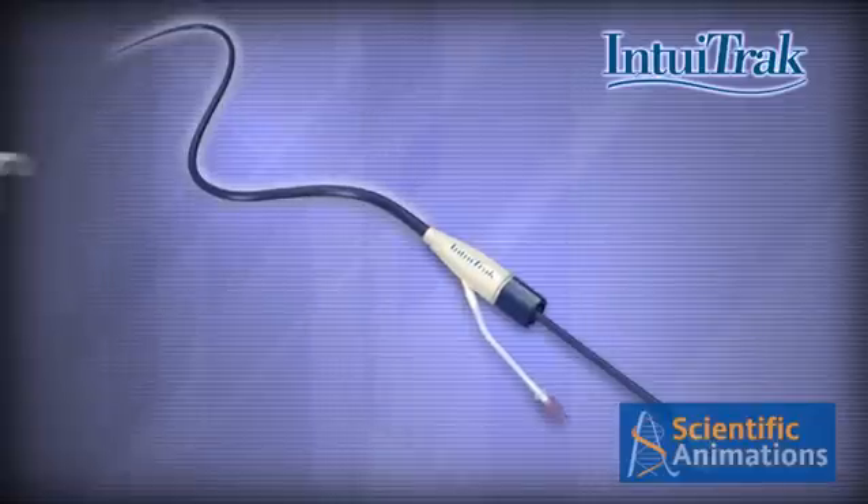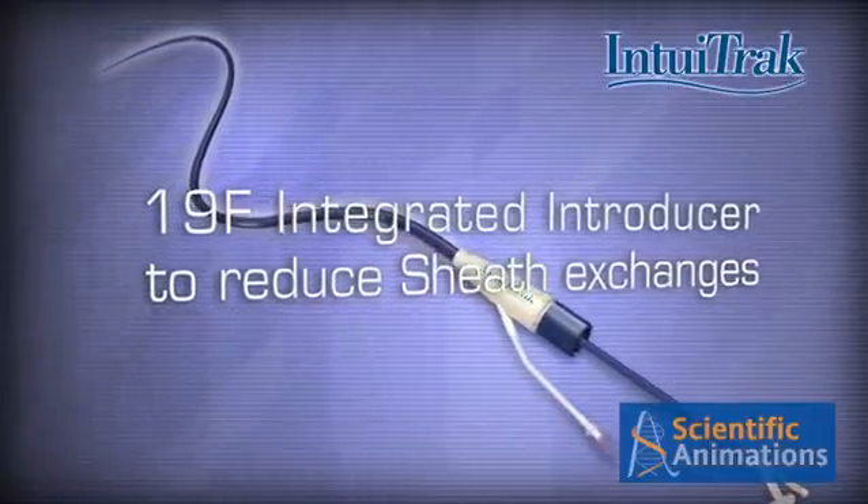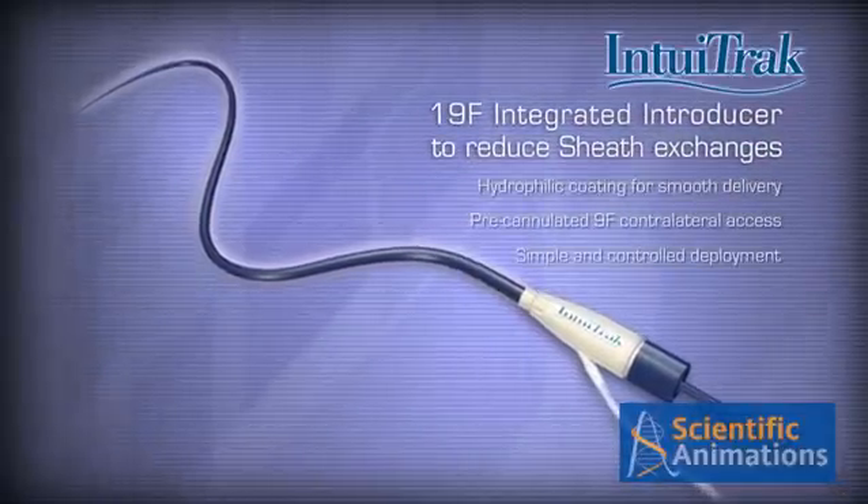The Endologix Intuitrack system is an integrated 19 French introducer sheath system that features low profile and hydrophilic coating to facilitate optimum flexibility and trackability.